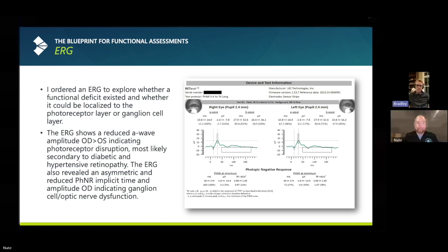Of note, the test does have a VEP in it. It is the unexplained vision loss, the visual evoked potential. The VEP is really indicated to try to figure out, is this organic vision loss or is this non-organic vision loss? It has a flash ERG. Remember, this is a flash test, a flash ERG. It has a flash VEP in it as well. Typically, the pattern VEP has more utility and more value, but you can use the flash VEP to give you an idea how the visual pathway is responding to a flash stimulus. So there is a VEP in the RETeval.